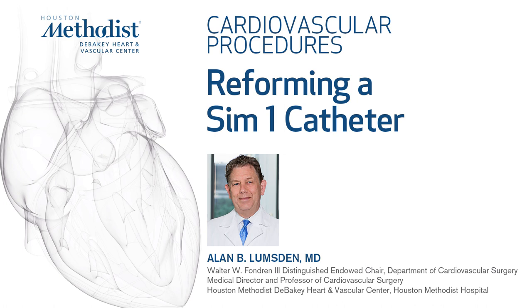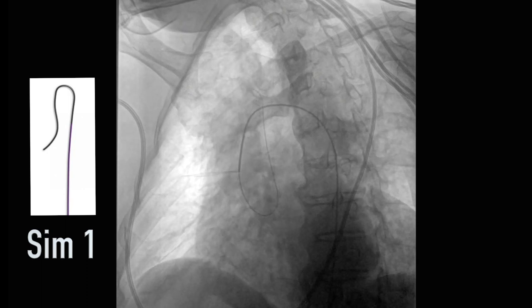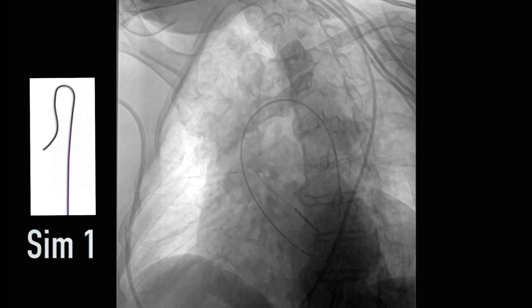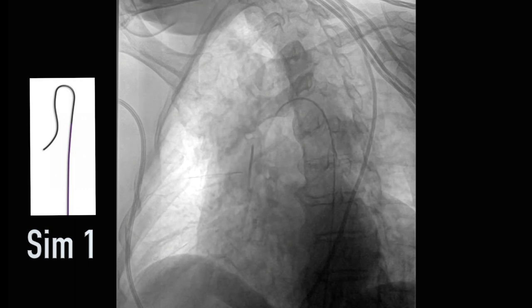In this video we're going to demonstrate the technique for reforming a SIM-1 catheter. The wire has been placed up and over the aortic arch. This is a floppy wire — either a glide wire or a Benson wire. We then use the valve to support the SIM-1 catheter as it tracks up and over the arch.